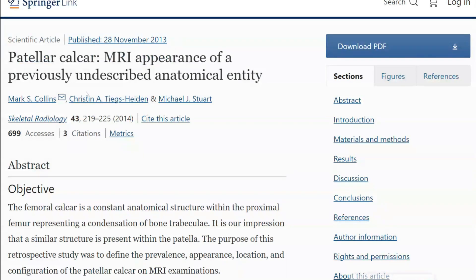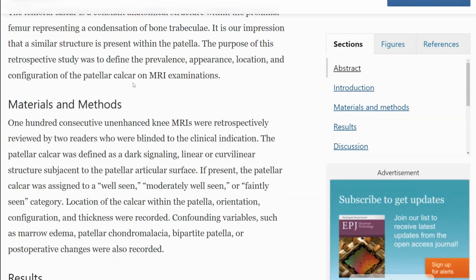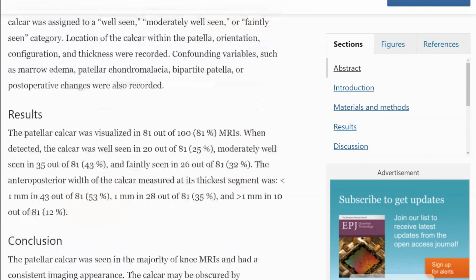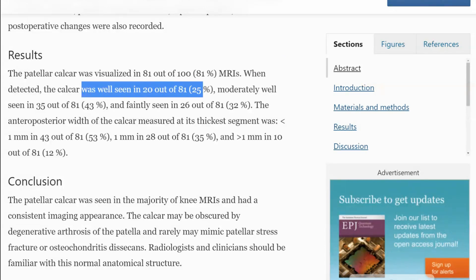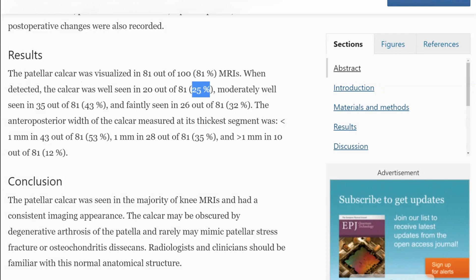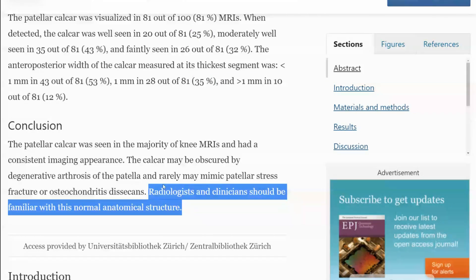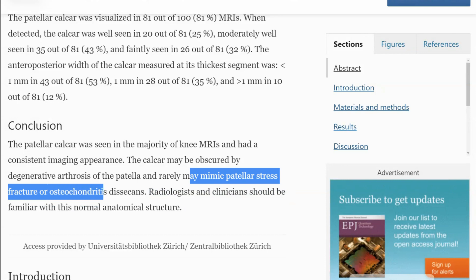Somebody realized it was there and described it. Looking at the results from the abstract: the patellar calcar was visualized in about 80% of MRIs — so you have definitely seen this. It was well seen in just about one third to one quarter of cases, about 25%. Sometimes it's very hazy and you don't see it so nicely. Very interestingly, it was always on the lateral side.